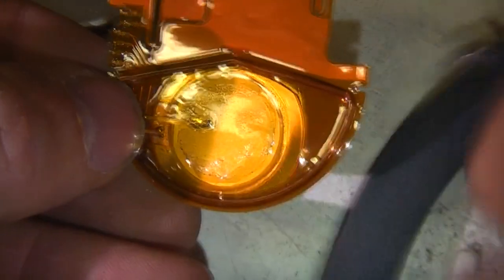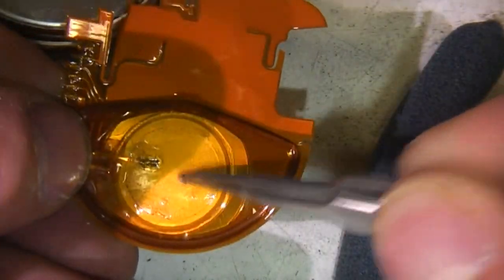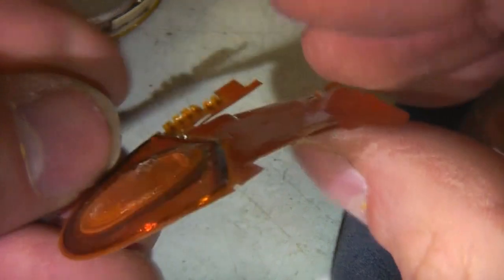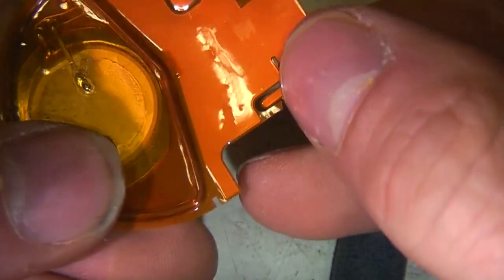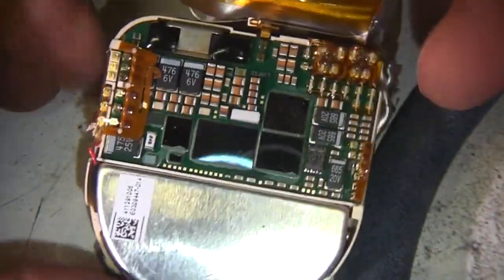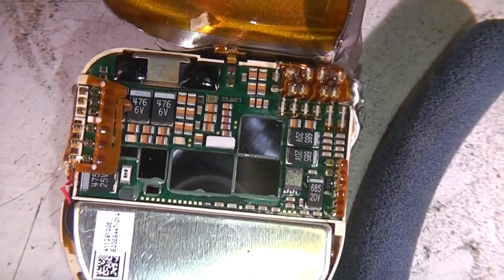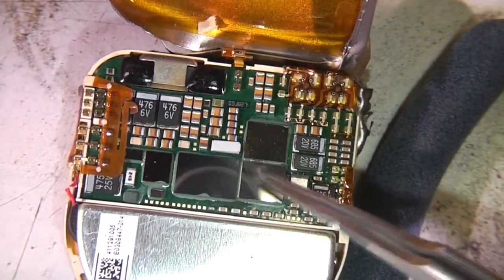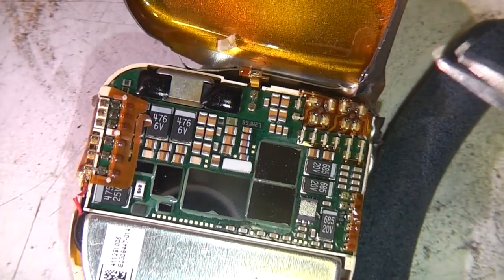Right, so this top flex has an antenna coil around here. It's also got a piezo sounder, so that's what was making that noise. And in here we can see lots of very small IC packages. You can just see the backs of the chips here, and these will be BGA packages down onto the main board.